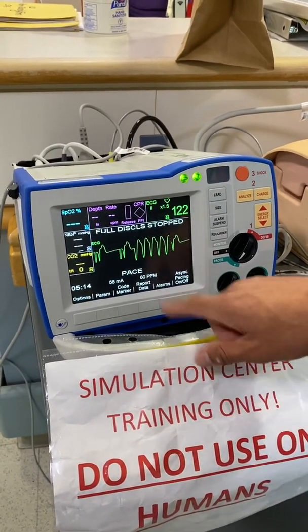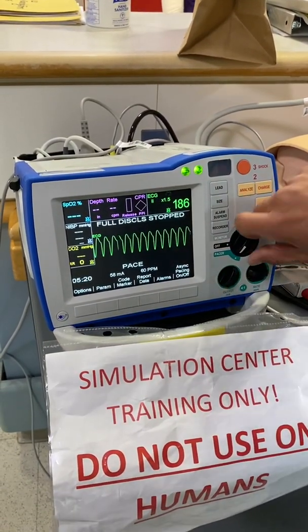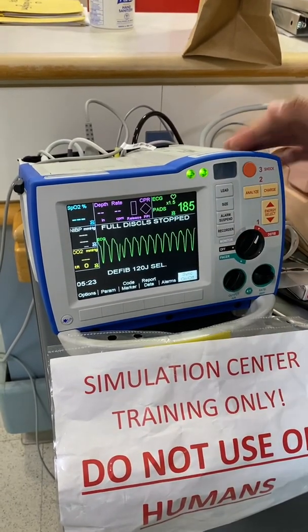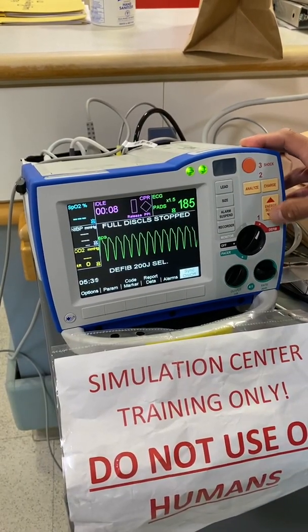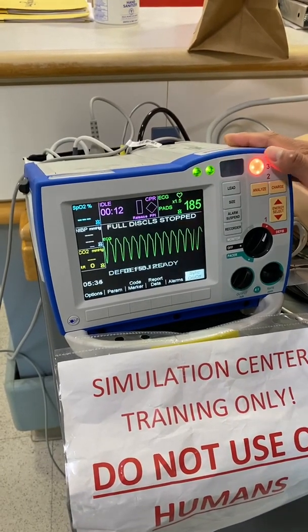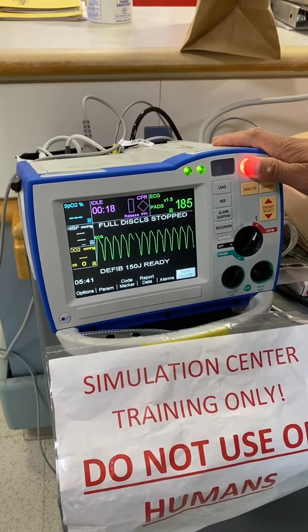Now say I have this rhythm — ventricular tachycardia, patient is pulseless, and I need to defibrillate. So I go to manual defib. I want to go up in energy — let's do 150 joules, charge. I'm going to verbally and visually clear the patient just like I did with cardioversion. Everyone cleared. I'm looking at the patient as I press the shock button.